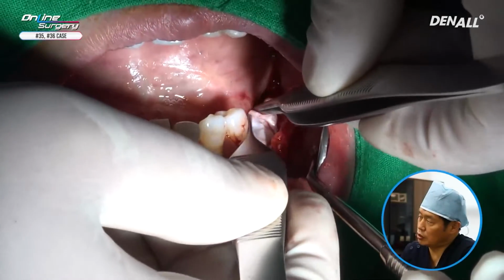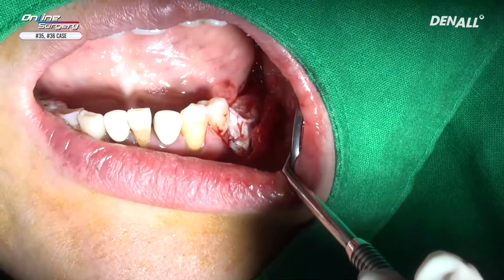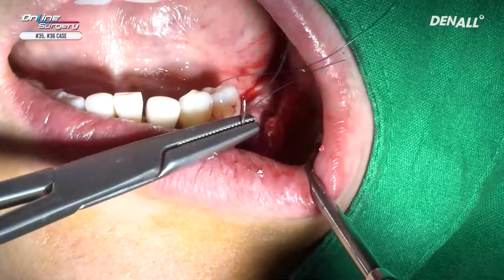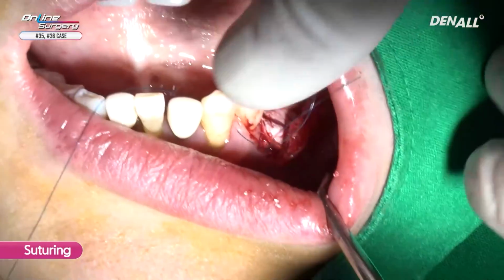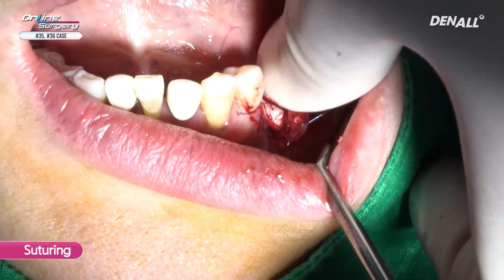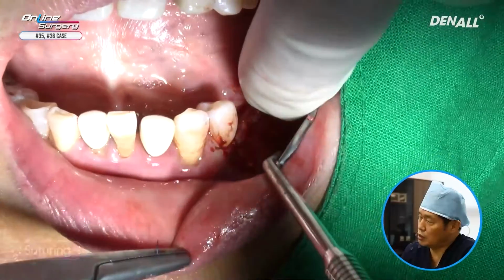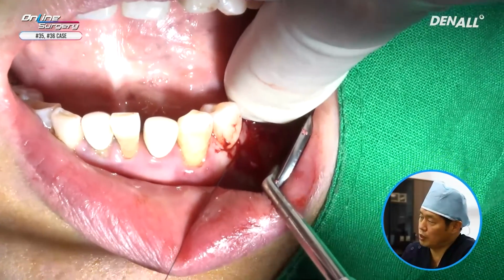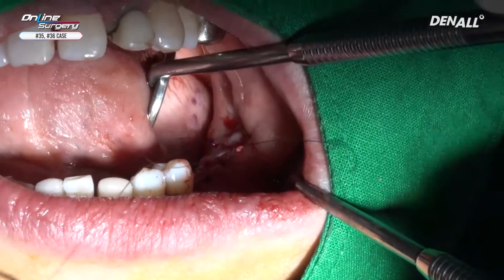One more layer was used, so a total of 2 layers of membrane was used. GBR was done only on top, so even without periosteal releasing incision, flap can be closed nicely.